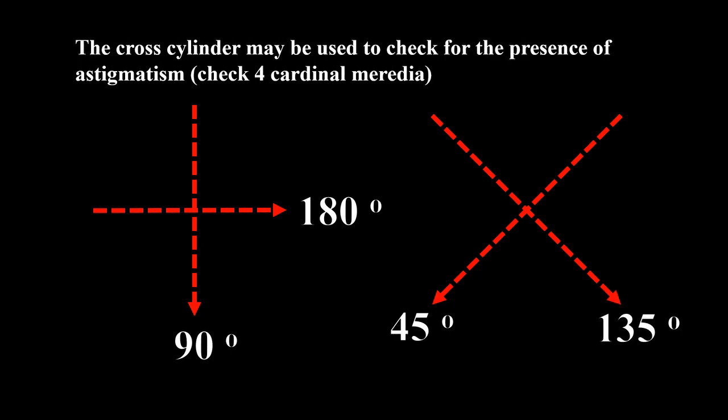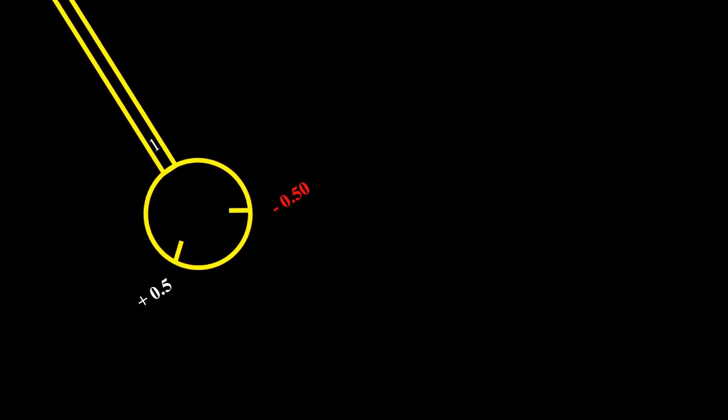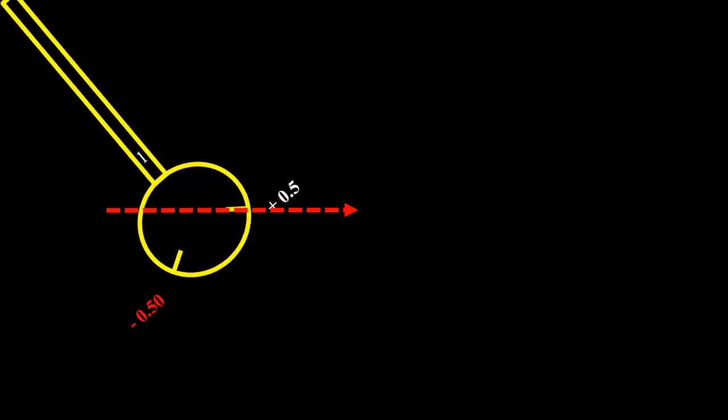In case of using the cross cylinder, we check these 4 cardinal positions. This is vertical, plus or minus. This is horizontal, plus or minus. This is oblique. And this is the second oblique.